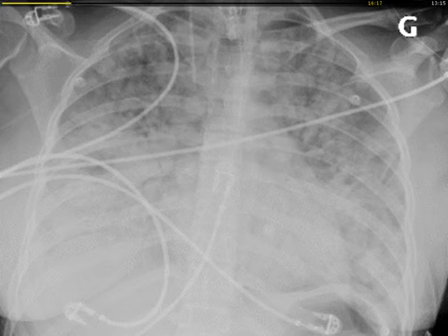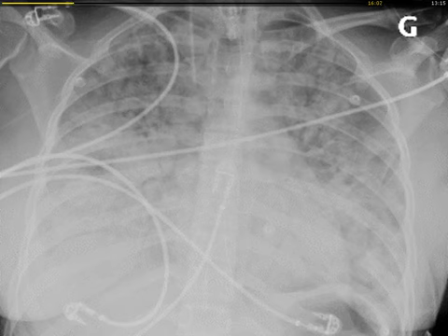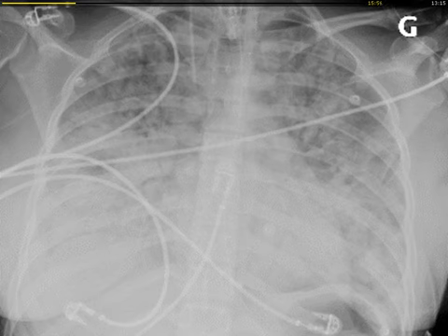And so with these settings, the end-tidal CO2 target range by default is 37 to 44 millimeters of mercury, keeping in mind that there may be a gradient between end-tidal and PaCO2, and the SpO2 target range is 92 to 96%.